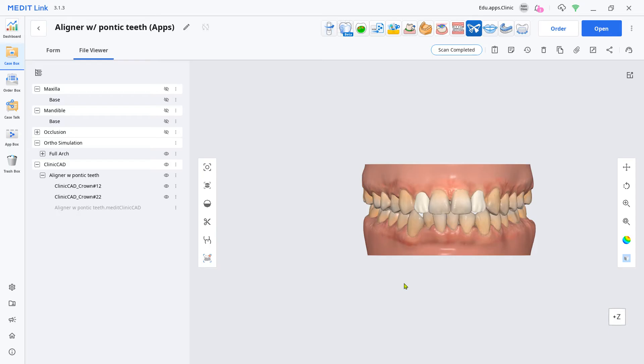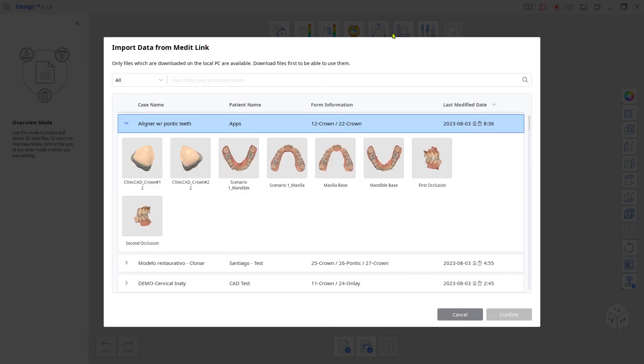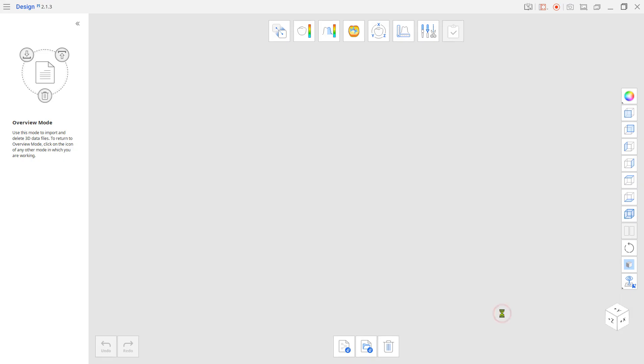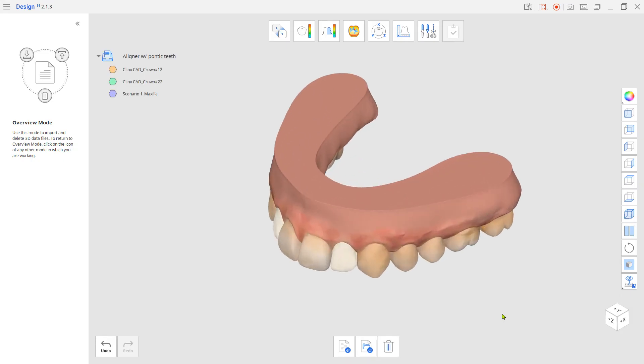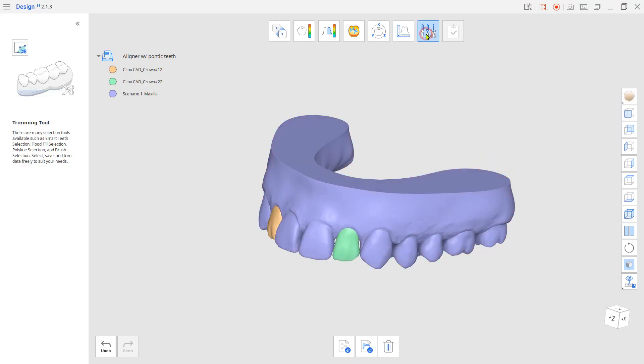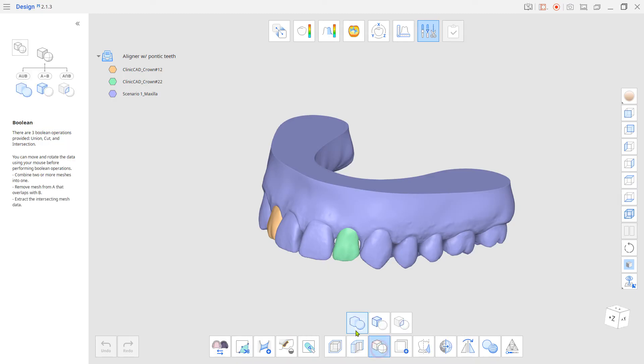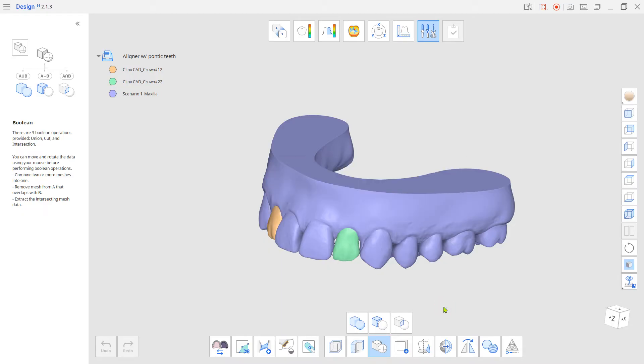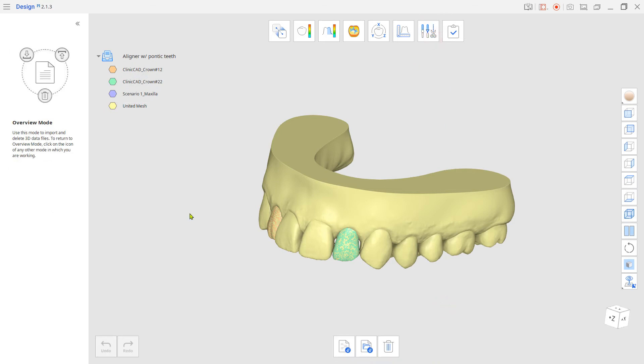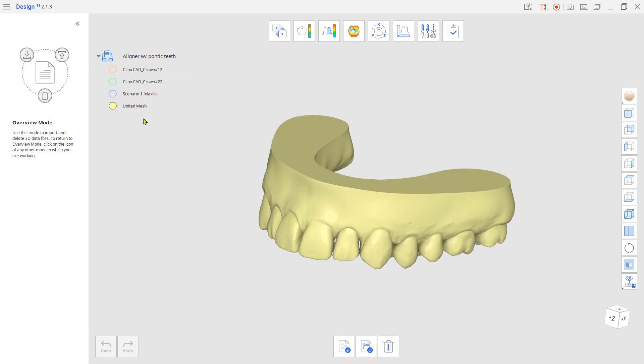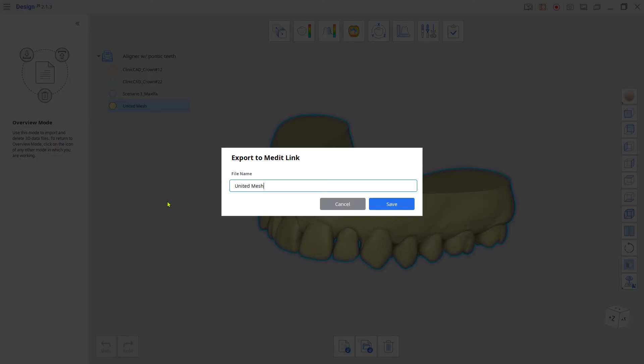Load the scenario maxilla and the two pontic crowns from the design app. Go to edit mode and merge them together with the boolean union tool. Export the united maxilla and exit without saving.